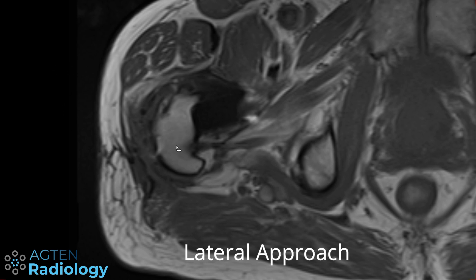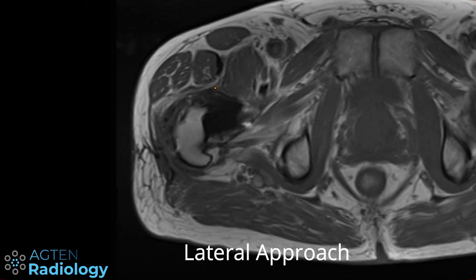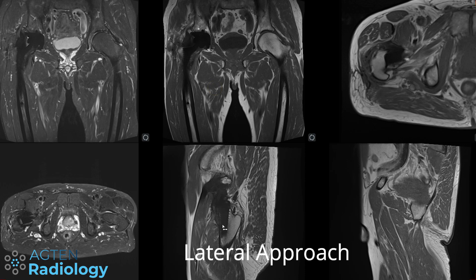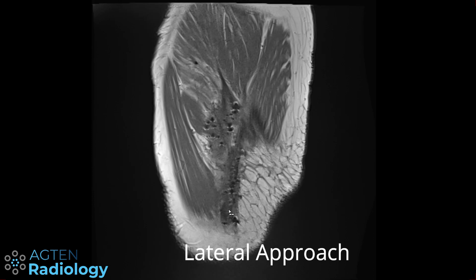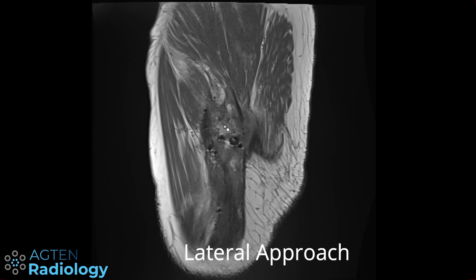Sometimes these susceptibility artifacts are not that obvious. One tip here is to go to your sagittals and go to the most lateral portion or section of this sequence — there you can see the susceptibility artifacts and also the scarring much more easily.